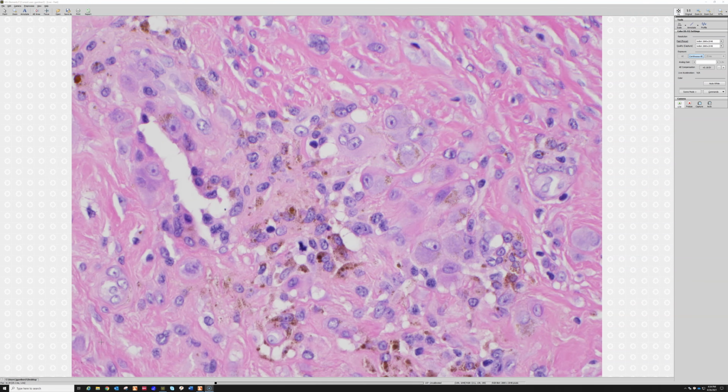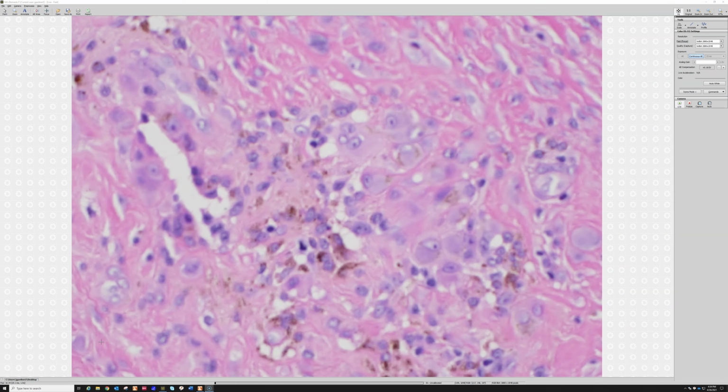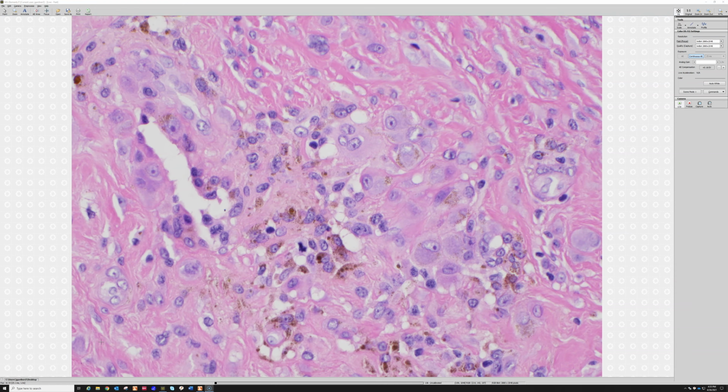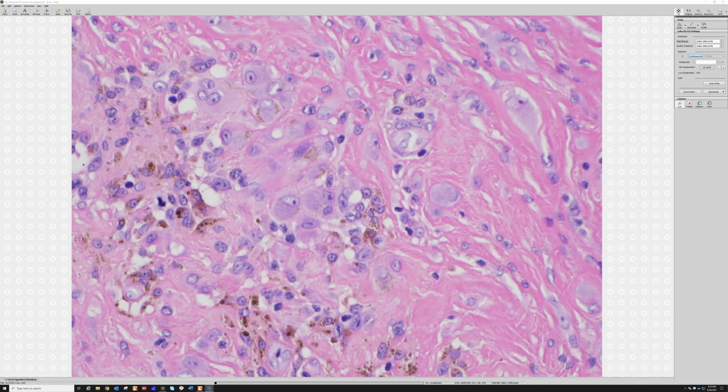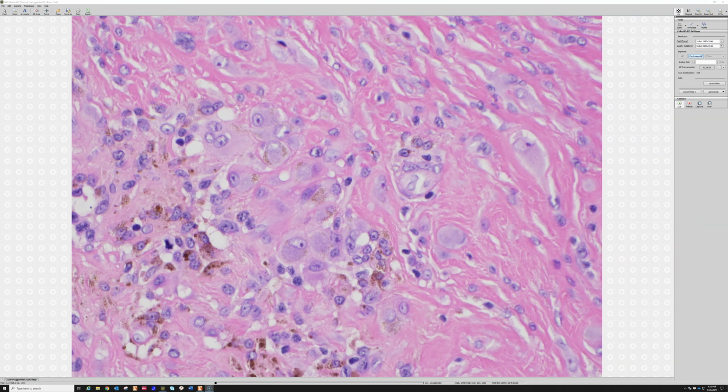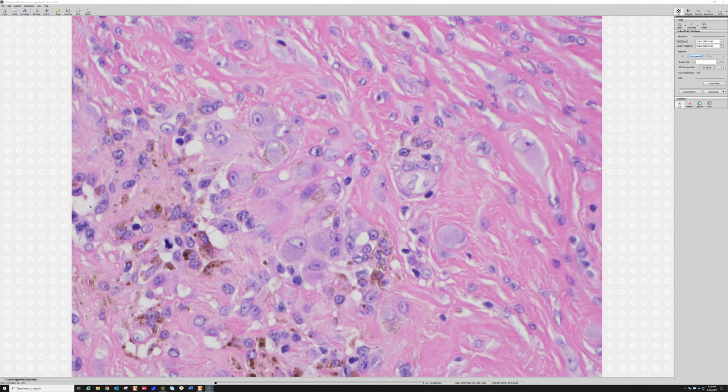So the distinction is based on the clinical and radiographic features. If I just have a fragment, I'll call it tenosynovial giant cell tumor. And then in the comment, I'll say it could either be the diffuse or the localized type. It totally depends. You have to correlate radiographically or with the intraoperative findings, something like that. So what I want to see, though, are these plasmacytoid histiocytes that have an eccentric nucleus. If you're lucky, you'll see this ring of hemosiderin, which I find a very characteristic finding for this tumor.